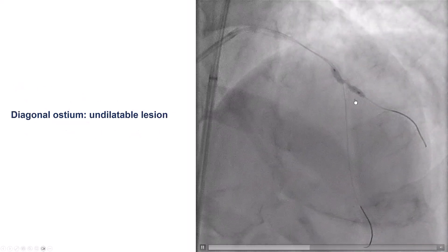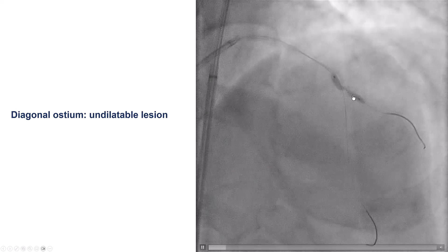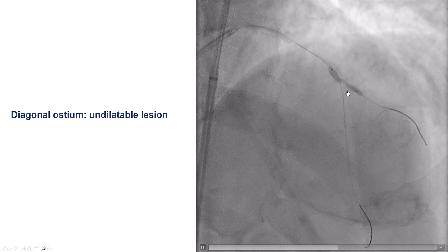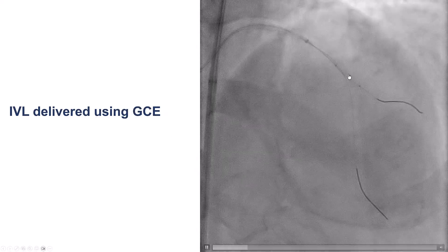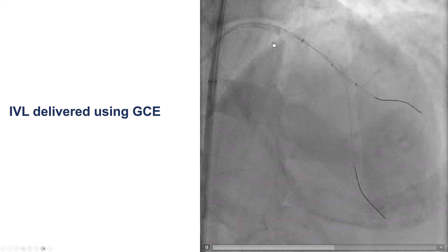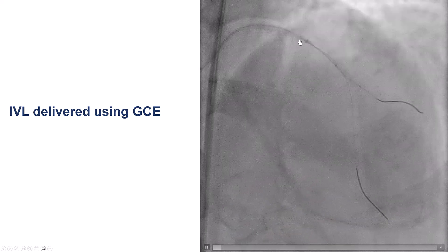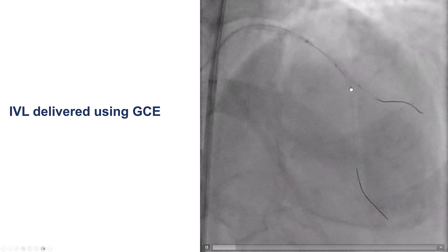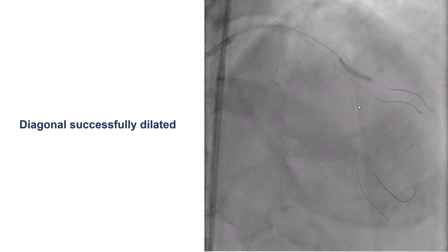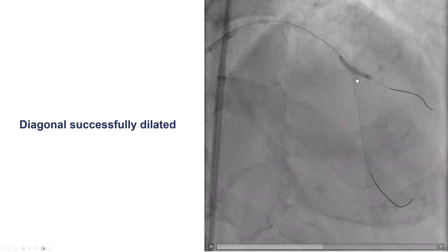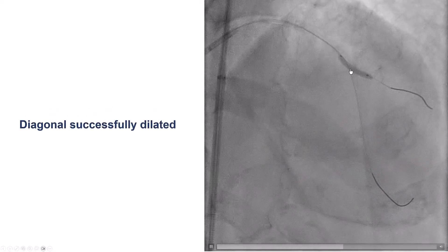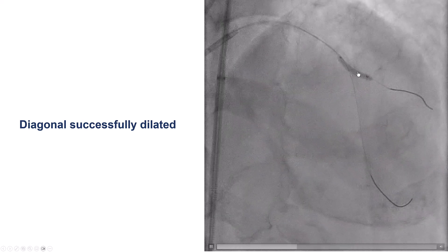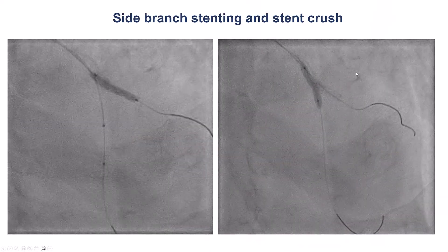We tried to pre-dilate the diagonal, but this was not possible, likely because of the severe calcification, so we did intravascular lithotripsy. We had to use a guide extension to deliver the lithotripsy catheter to the diagonal. After giving several pulses of intravascular lithotripsy, we were able to expand the diagonal lesion.